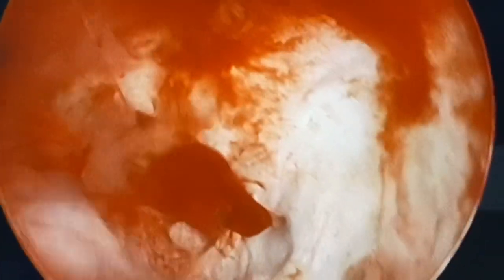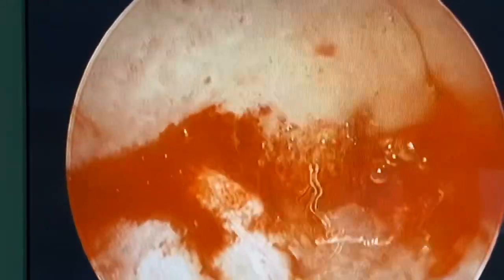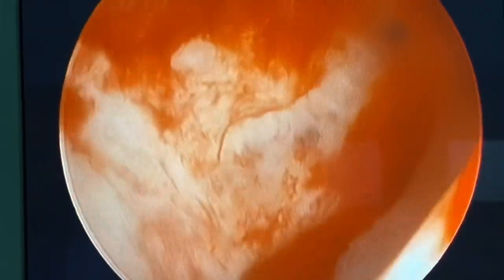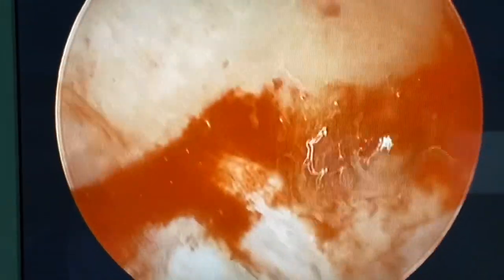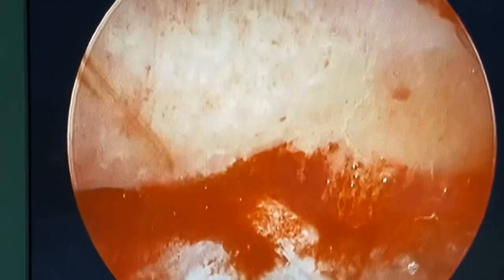Back again to the same case — we just corrected the residual part of the septum. Actually it was not just a residual septum; there was also fibrosis and adhesion. We are now adding a complementary step: injection of PRP — platelet-rich plasma.